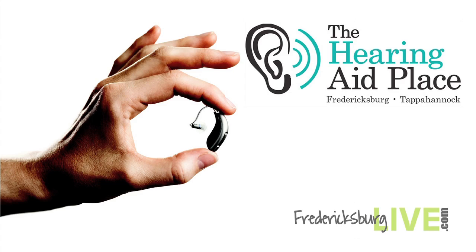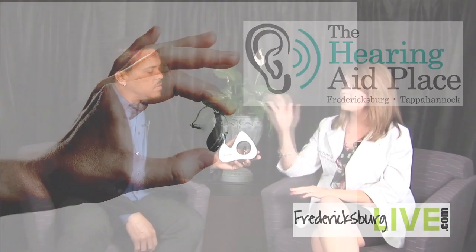They still do make custom pieces, so instead of having a behind the ear piece, you can have something that fits inside the ear like we were probably more used to seeing. However, it depends on what type of loss you have. If you have a more severe loss, we're concerned with closing off the ear canal and giving you more amplification. Whereas this sort of device is what we consider an open fit, so it's allowing you to hear naturally and then giving you a little bit of amplification when you need it.